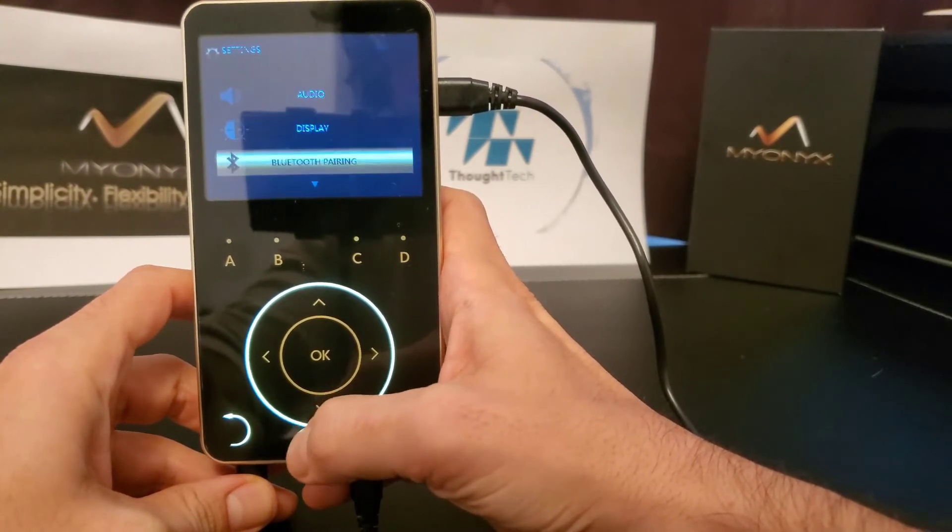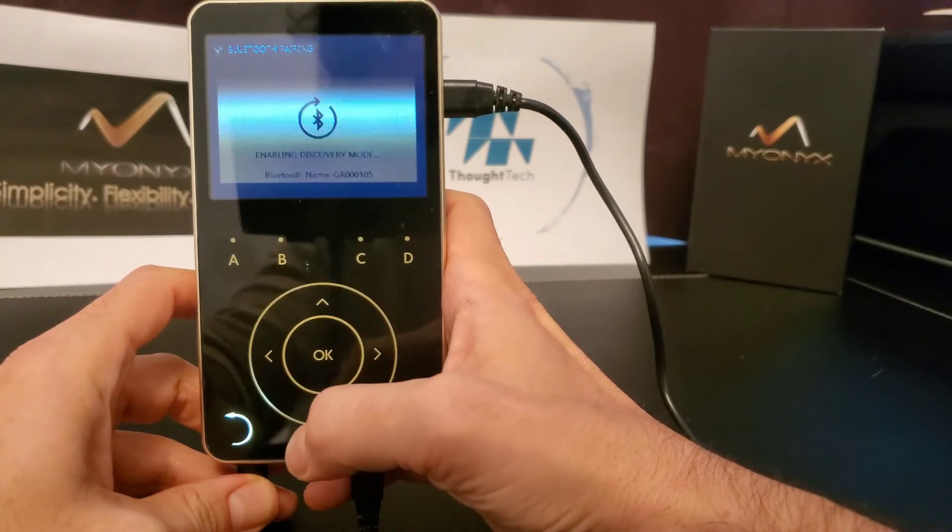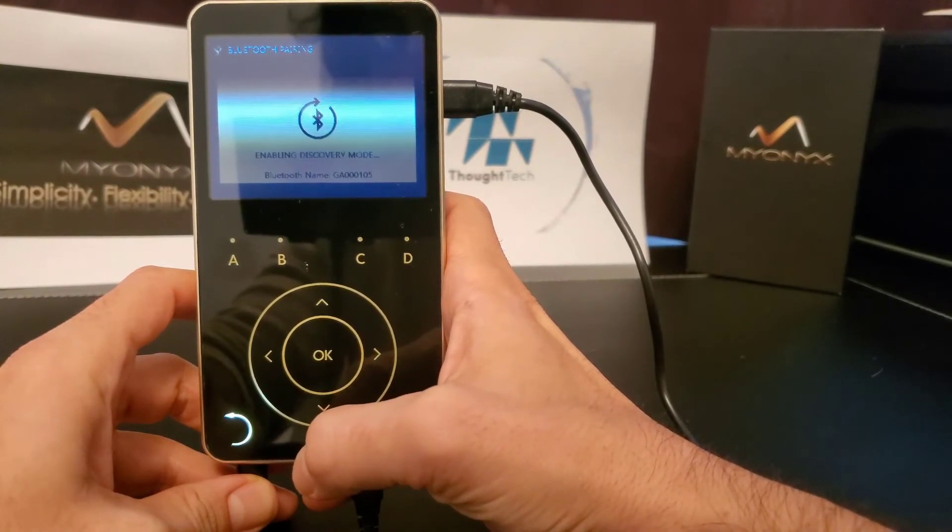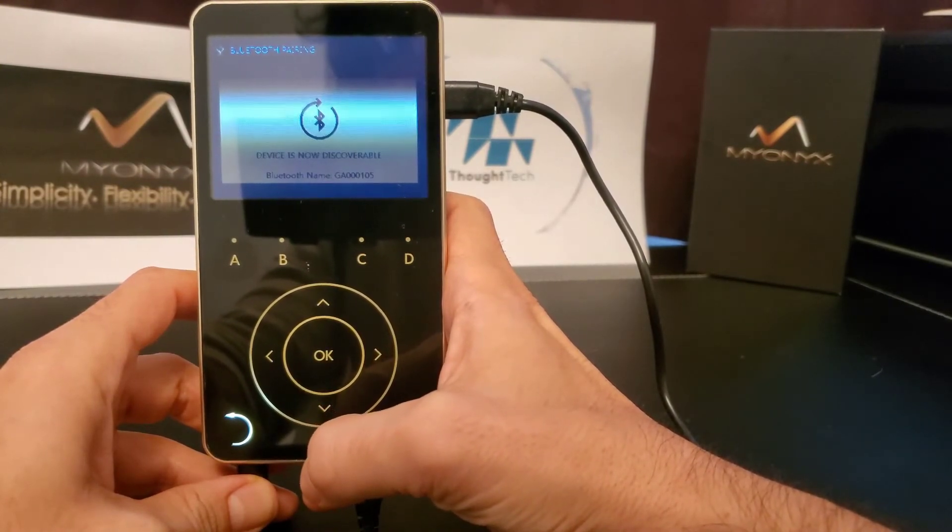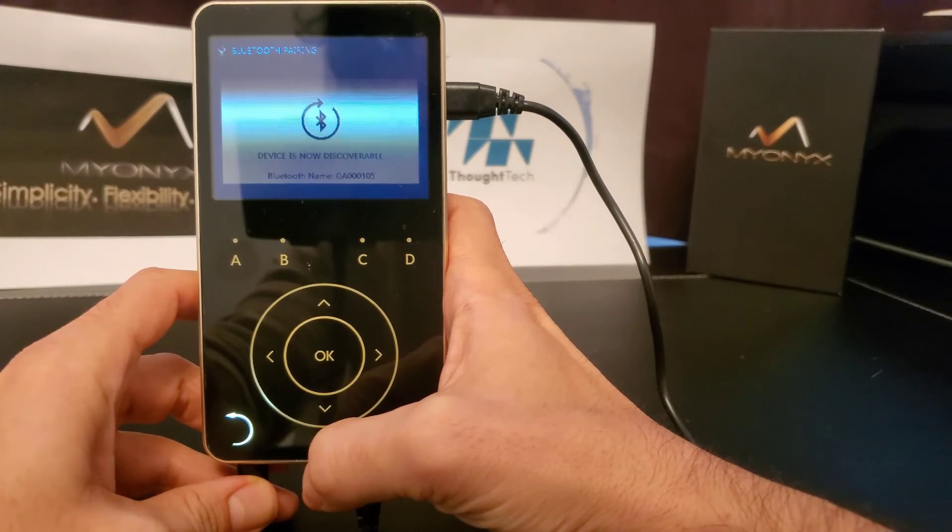After a couple of seconds the device will become discoverable to other devices. The device name will appear on the Myonix screen.